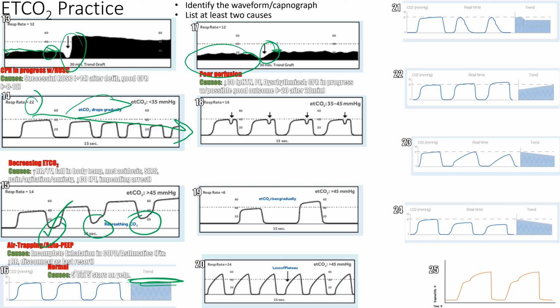So then what else? Number 18. Neuromuscular blockade. They're not adequately paralyzed, or they're coming off paralytics. So the vent's doing all the work for them, and they're trying to take little baby breaths on top of that. You can see them take a little inhalation effort. As they draw gas in, they draw O2 in, you're not going to have CO2, so that's a little dip right there. Could that be any desynchrony? Maybe, yeah. You're going to definitely see some abnormal waveforms, and they're desynchronous. But it's pretty textbook where they're coming right back in as the ventilator is doing its thing. All right, number 19.